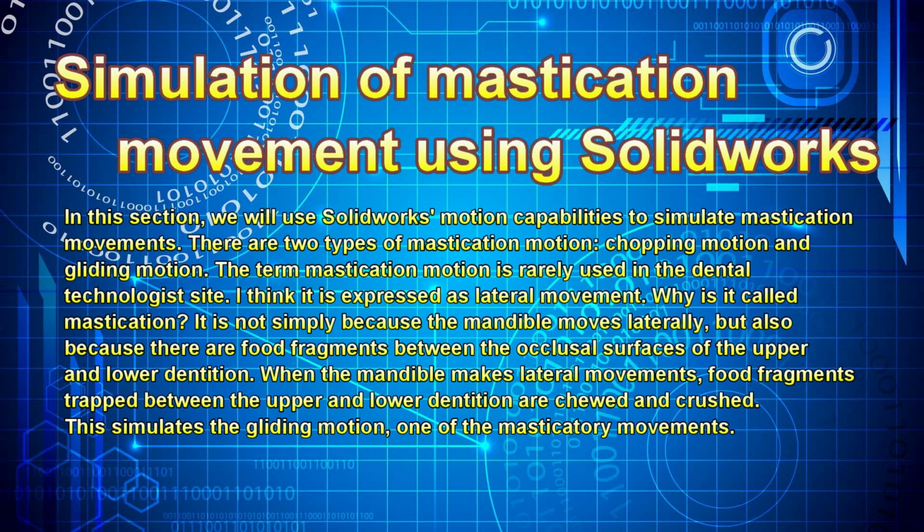In this section, we will use SolidWorks motion capabilities to simulate mastication movements. There are two types of mastication motion: chopping motion and gliding motion. The term mastication motion is rarely used in the dental technologist site. I think it is expressed as lateral movement.